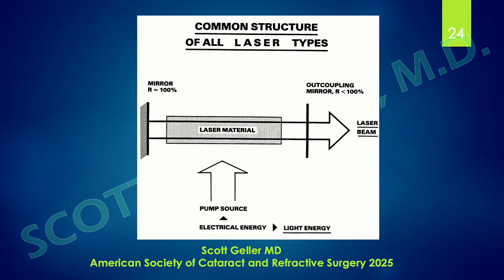So what's the common structure of all lasers? It's very simple. There's a pump source, which is driven by electrical energy going into light energy that is focused on the material used to create the laser phenomenon. In a YAG laser that we use, at least the one I use, it's a man-made crystal.